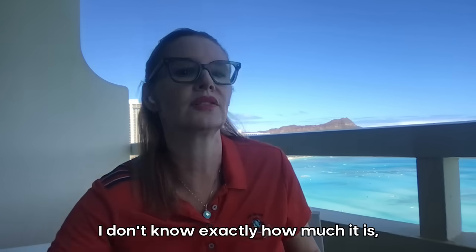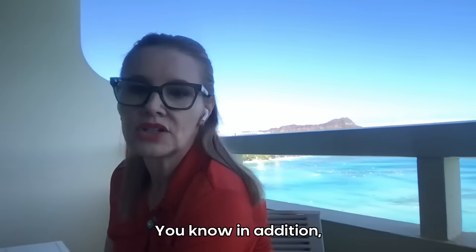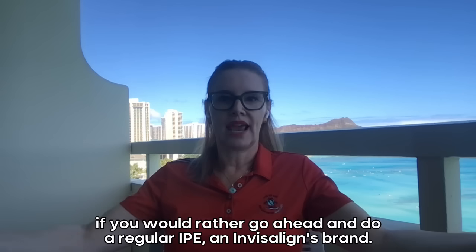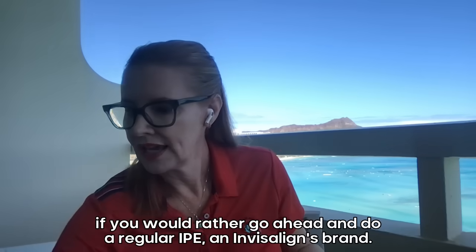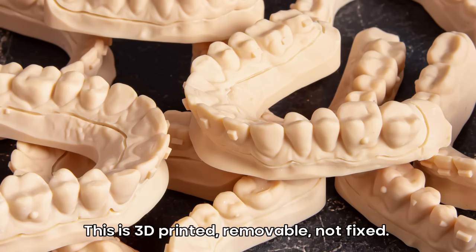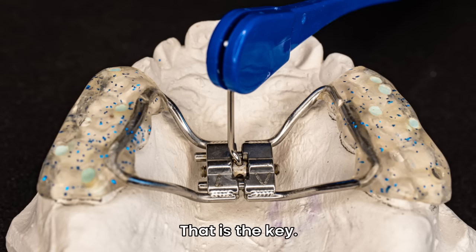For an extra $50 to $70, that seems to be about the difference for 3D printed. In addition, if you'd rather go ahead and do a regular IPE — Invisalign's brand — this is also 3D printed. This is 3D printed and removable, not fixed. That means it has to stay in 24/7. That is the key.